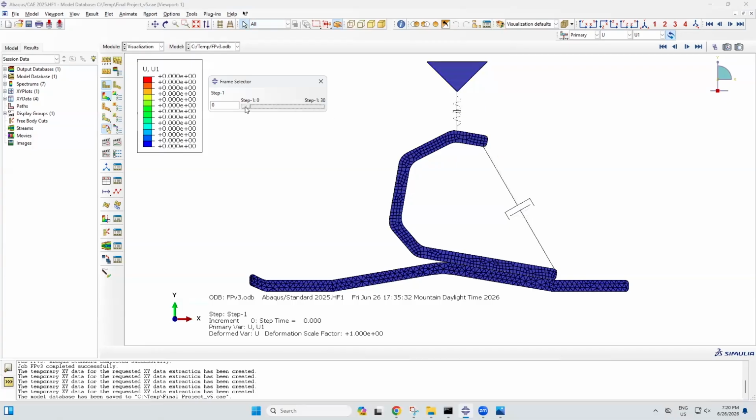Going over again, you can see where the part goes down and then back up right in between steps 1 and 2. This is showing that the part has gone past equilibrium in step 1 and then is trying to return to it in step 2 as it slowly moves back up until it reaches equilibrium in step 7 and remains there until the end of the animation.